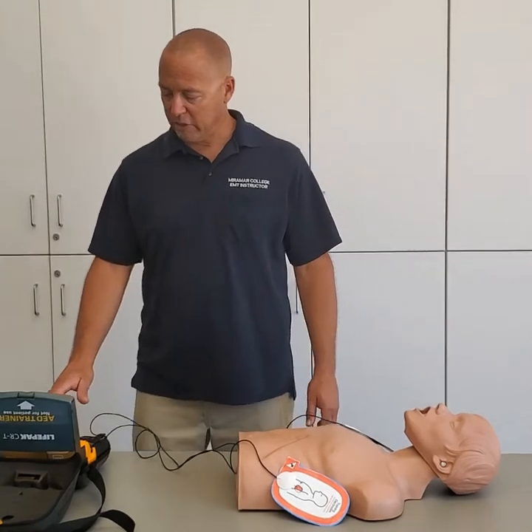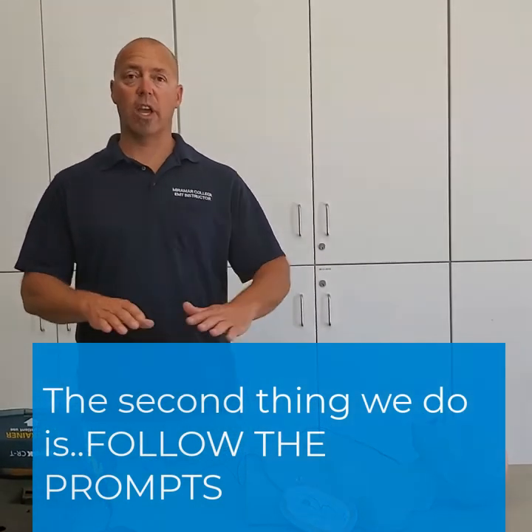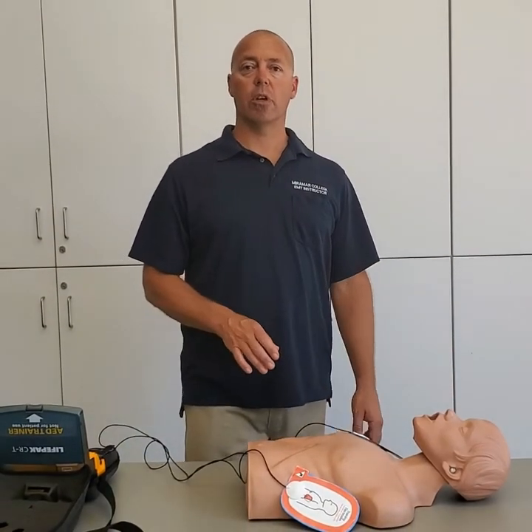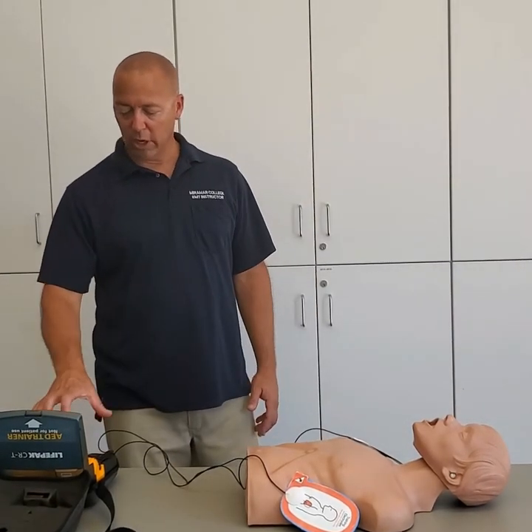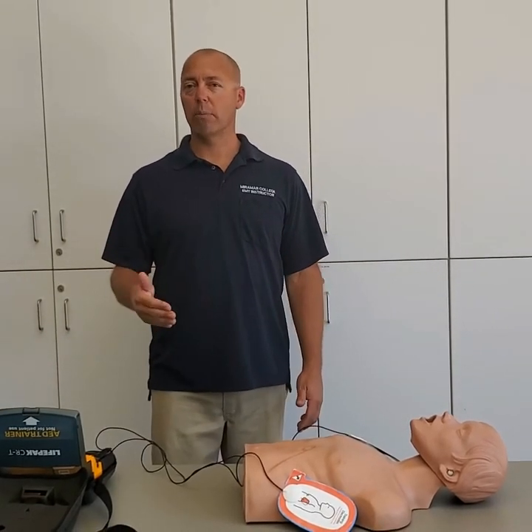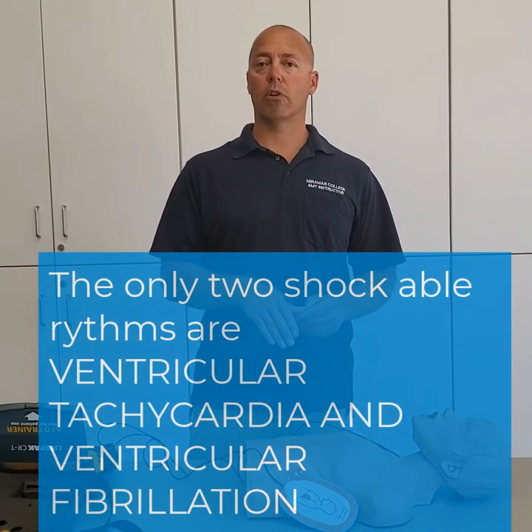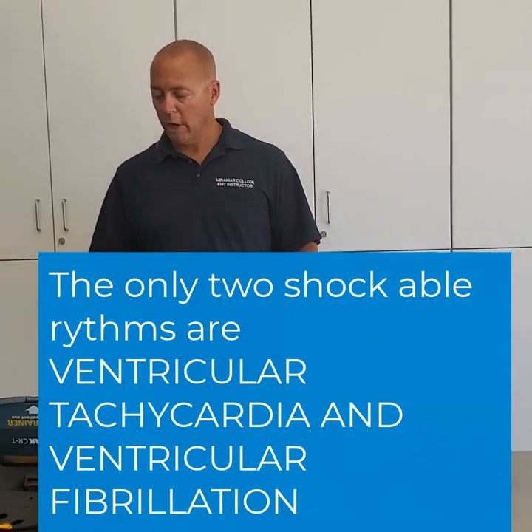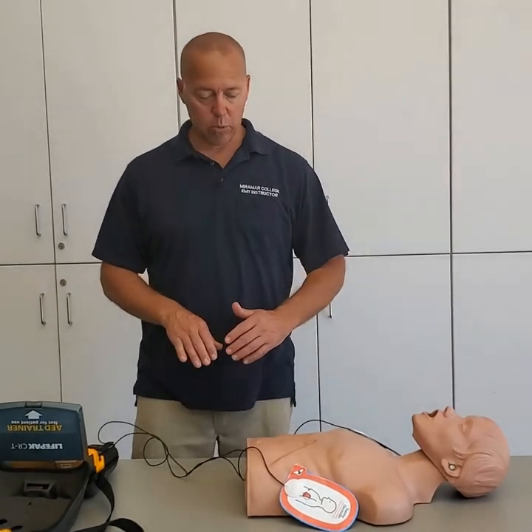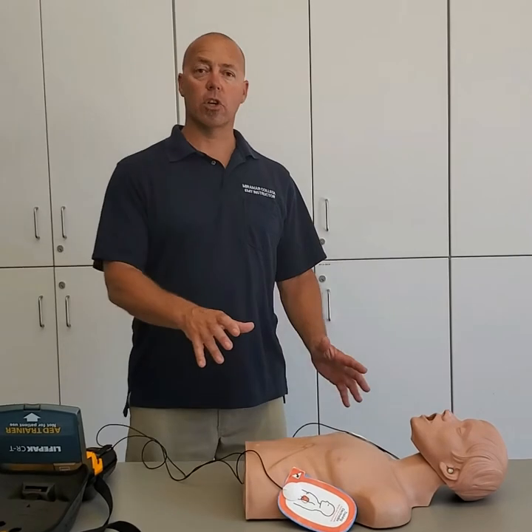Once the pads are on, simply follow the prompts on the machine. The machine will tell you to stand clear while it analyzes — do not touch the patient during analysis because the machine will sense movement. It will take a couple of seconds to search for the rhythm. If it determines the patient is in ventricular fibrillation or ventricular tachycardia, it will want to deliver a shock. It will warn you again to stand clear, make sure nobody is touching the patient, and then hit the shock button to deliver the shock.